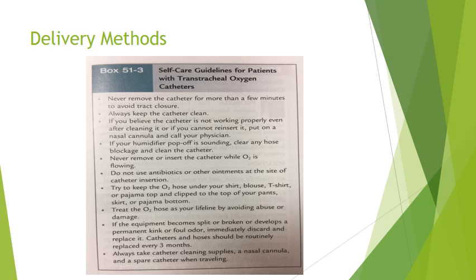I would imagine that the switch out is similar to a trach switch out. It should be fairly easy. The patient will be educated on how to do this, or the medical professional in the doctor's office will switch it out for them. But it sounds like this should be something that's fairly easy for the patient to do as well.